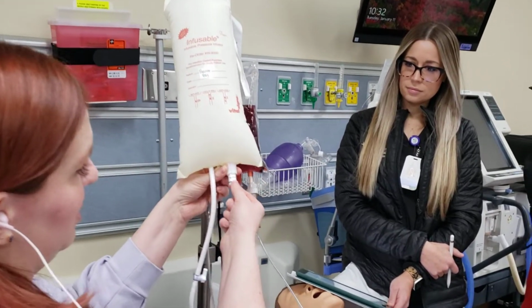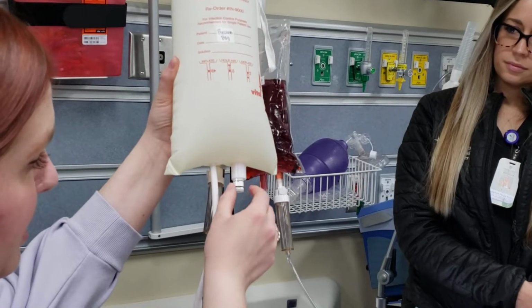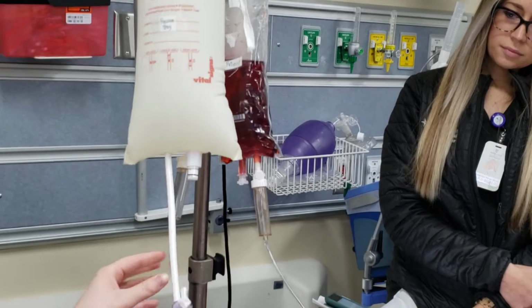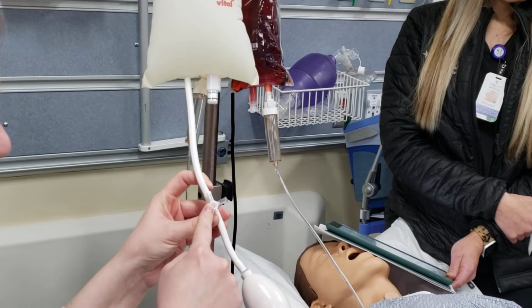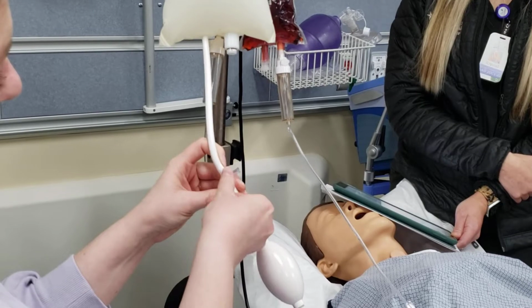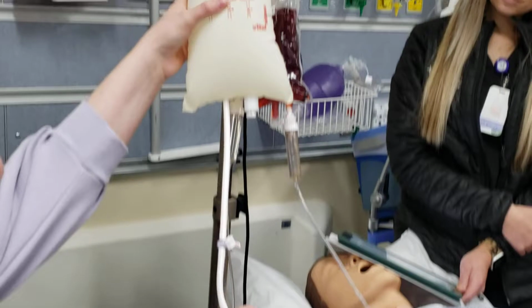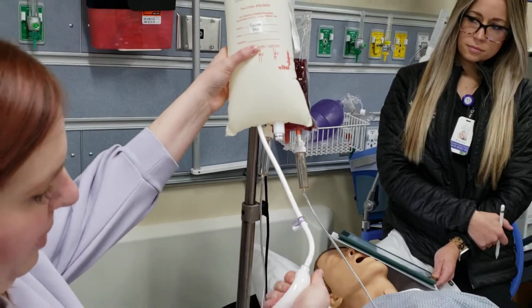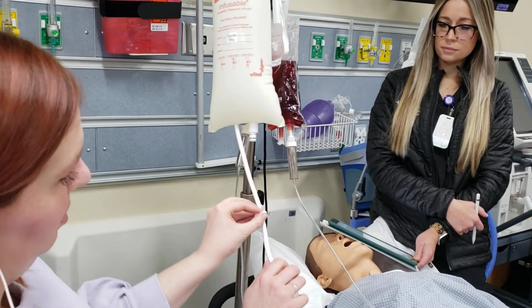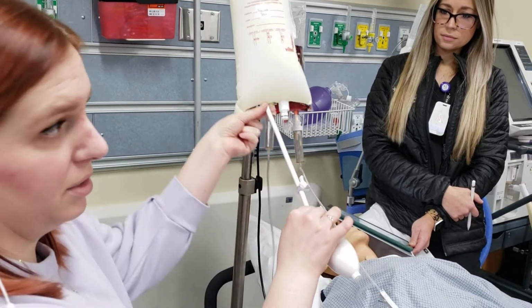This right here shows the pressure of our pressure bag. You can either feel the pressure or else you can pump it up until that green line shows you that you're in a good place with the pressure. You have a little stopcock here that can either turn off and release the pressure of the bag, turn off to this port to pump up the bag, pump up just like you're taking a blood pressure, or turn off towards the pressure bag in order to hold the pressure.